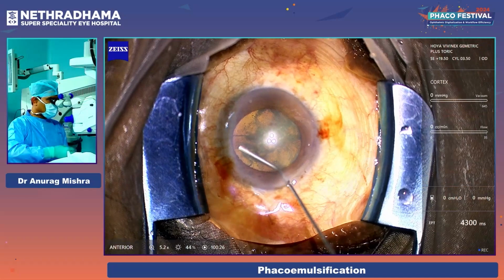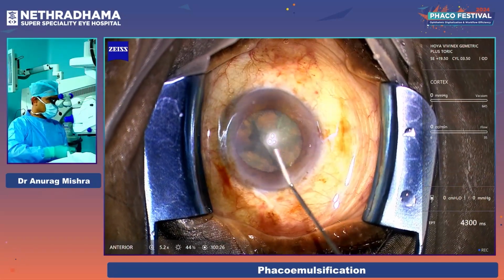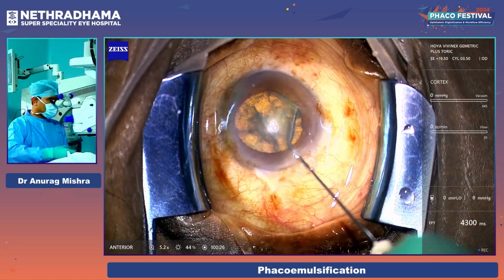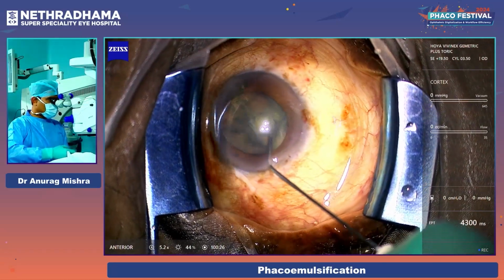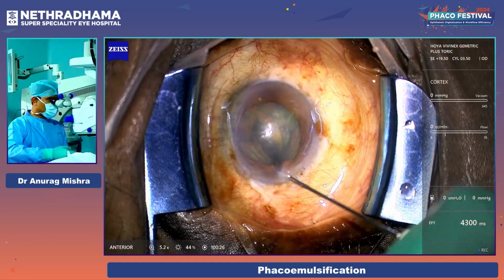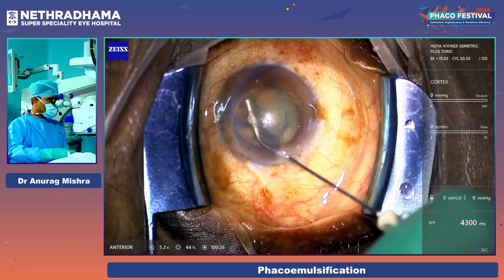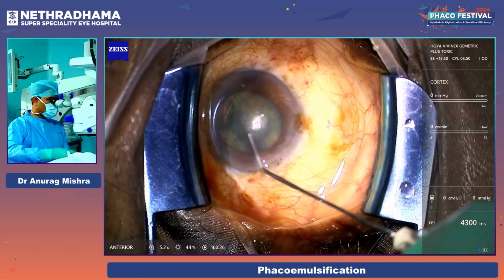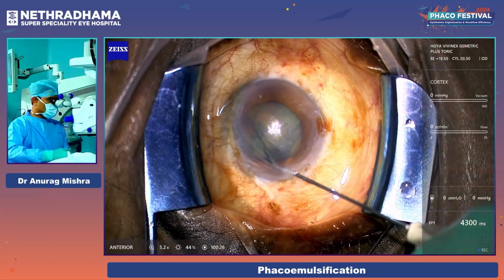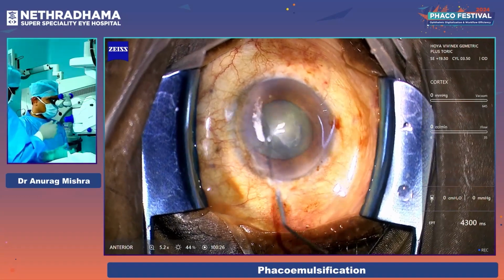And in fact, it has helped us a lot in customizing the need of the patient and thereby deciding whether we are going for a combination, a mix and match of Geometric and Geometric Plus in the two eyes, or Geometric in both eyes, or a Geometric Plus in both eyes too. Look straight, sir. So it gives us a lot of flexibility as far as that is concerned.